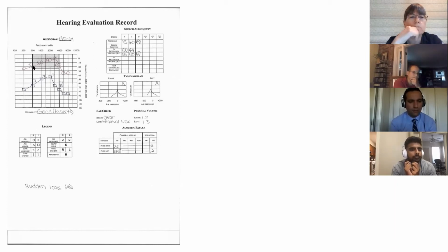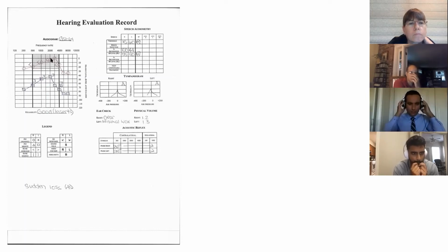The right one, the right is round. And so that's how I remember. Right is round, and it's also red. So it's got 3 R's. That's the easy way to remember it. So here, they don't have an air bone conduction. It's the left ear they have hearing loss, and right ear is normal. Correct.